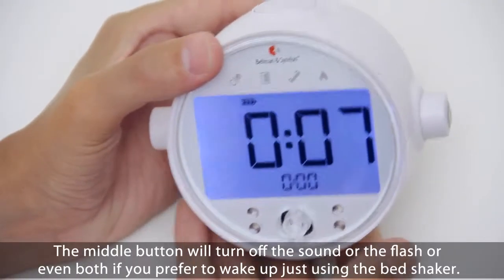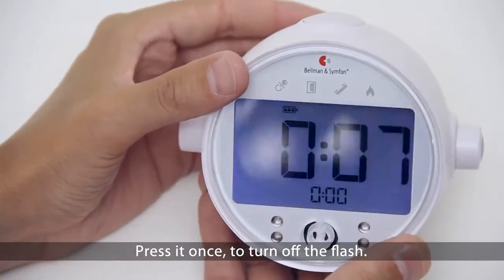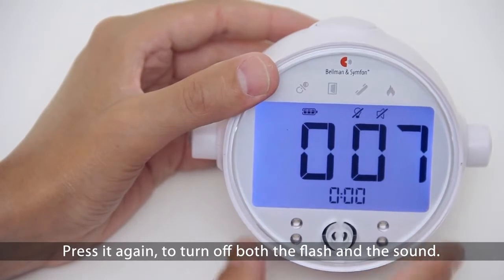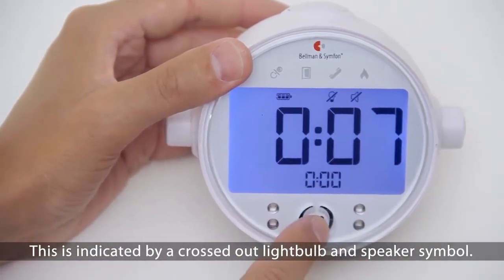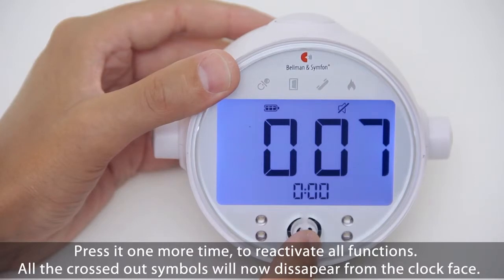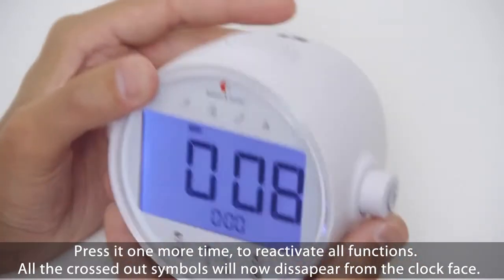The middle button will turn off the sound or flash, or even both if you prefer to wake up just using the bed shaker. Press it once to turn off the flash — this is indicated by a crossed out light bulb. Press it again to turn off both the flash and sound — indicated by a crossed out light bulb and a speaker symbol. Press it again to turn off just the sound, indicated by a crossed out speaker symbol. Press it one more time to reactivate all functions. All crossed out symbols will now disappear from the clock face.